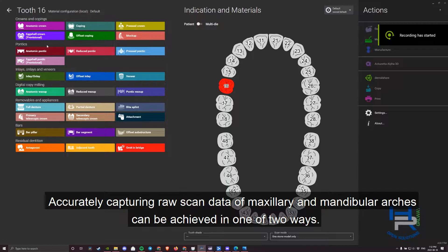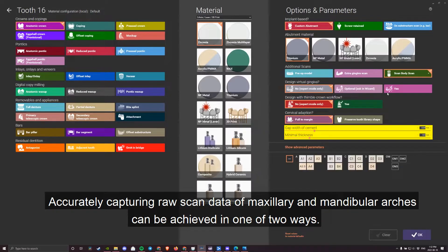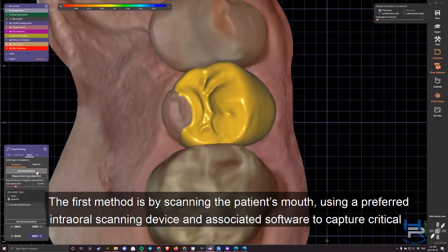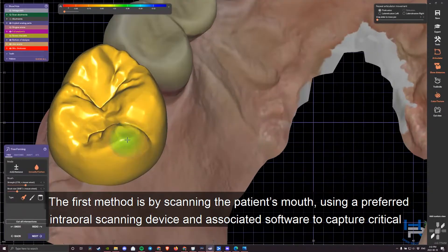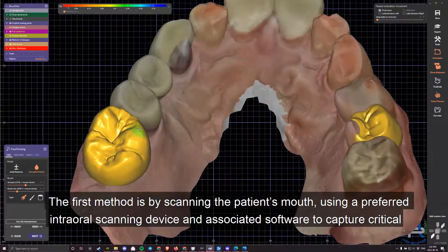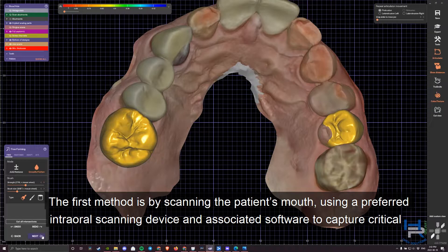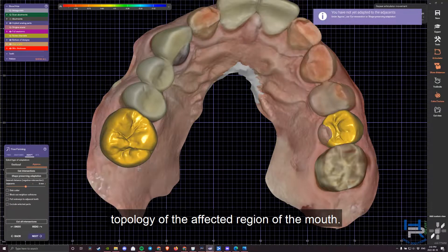Accurately capturing raw scan data of maxillary and mandibular arches can be achieved in one of two ways. The first method is by scanning the patient's mouth using a preferred intraoral scanning device and associated software to capture critical topology of the affected region of the mouth.